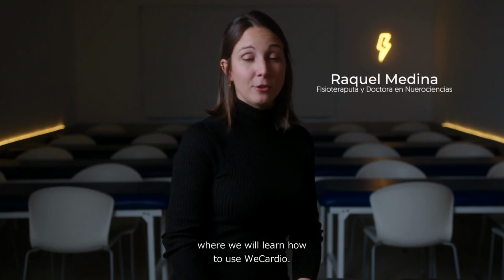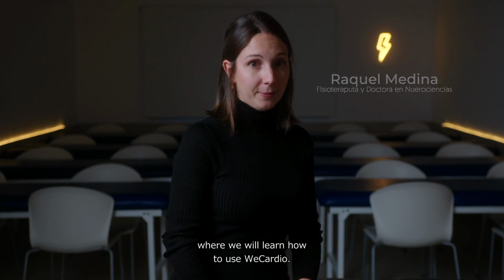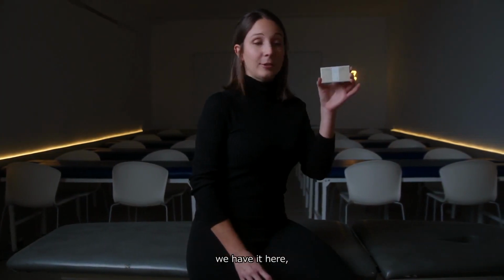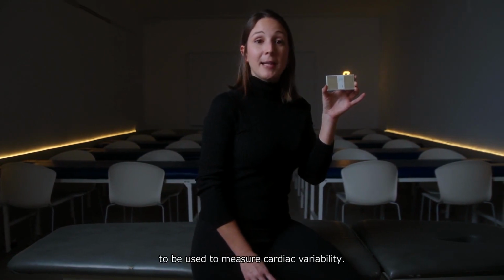I welcome you to this first part where we will learn how to use Wecardio. We must remember that Wecardio is a small, portable device. We have it here, to be used to measure cardiac variability.